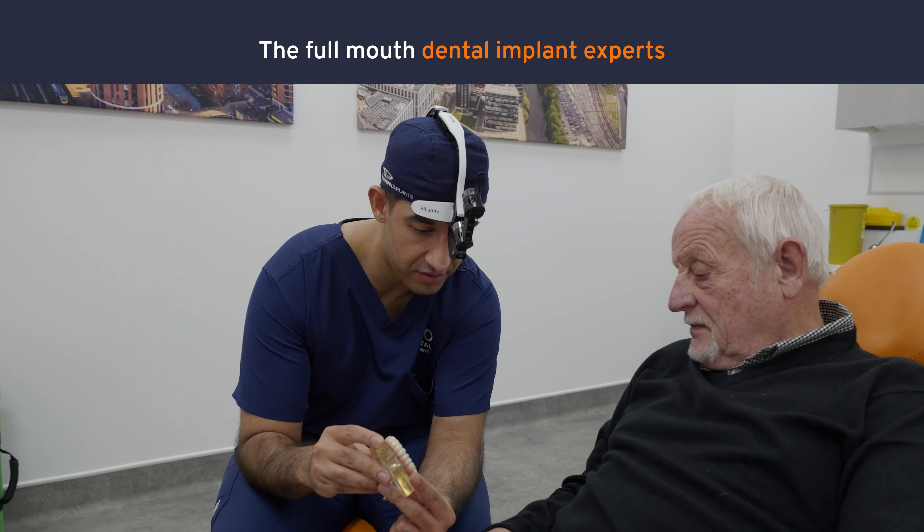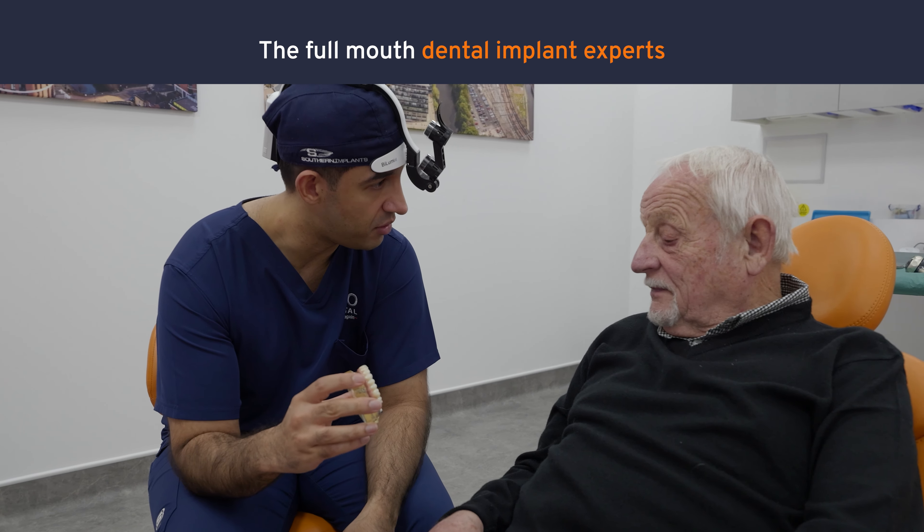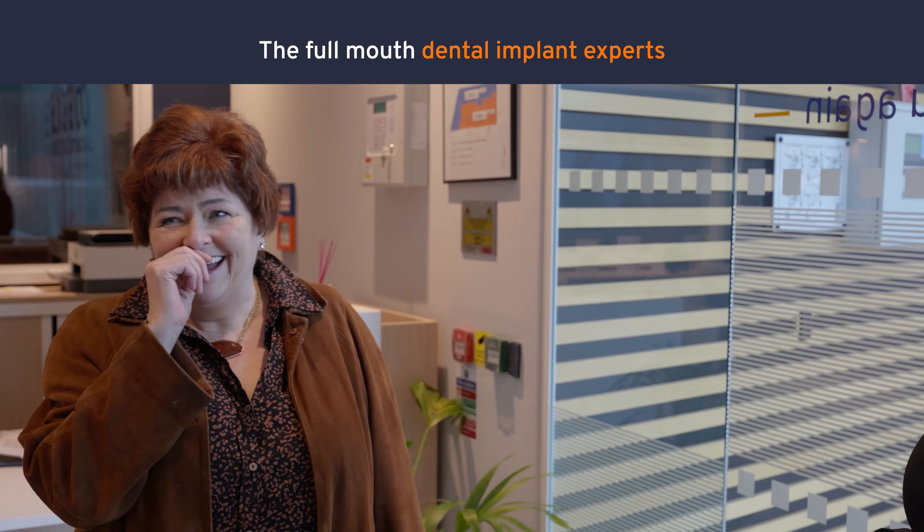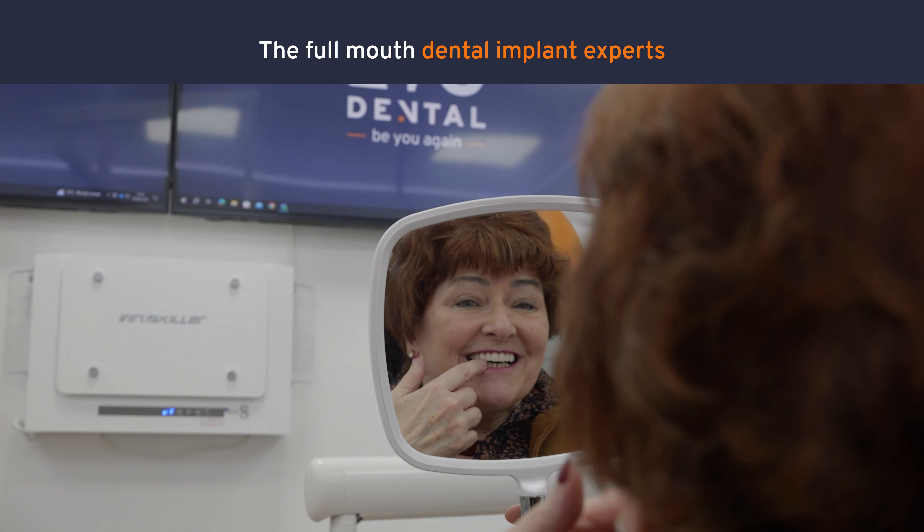The difference between that and an EVO Advanced is the addition of two extra implants at the back of the mouth, and that allows us to give you two extra teeth so you have a much wider smile and also improves your chewing function at the back of the mouth.